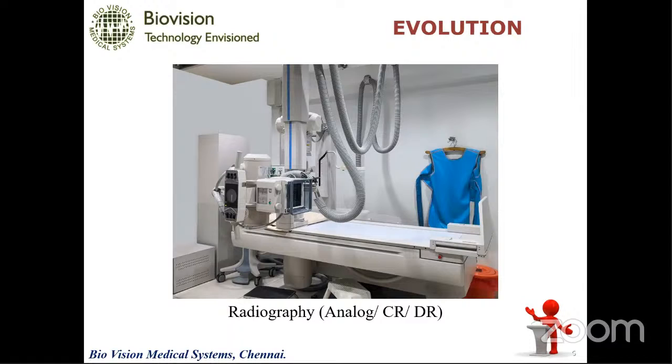And whenever we are using these kinds of radiological equipment, please be informed that we will have to get a certification from AERB, the Atomic Energy Regulatory Board, which will have to certify that your equipment is okay, for which you will have to submit a certificate to them called the Quality Assurance Certificate. These are additional details which we should know. So when I say quality assurance certificate, you will be checking the emission leakage everywhere. When you use a C-arm, just nearby that X-ray tank, at a particular distance from that X-ray tank.